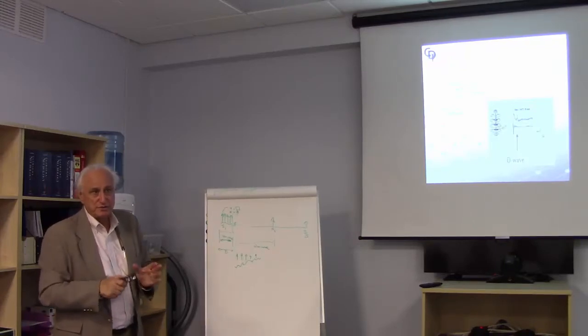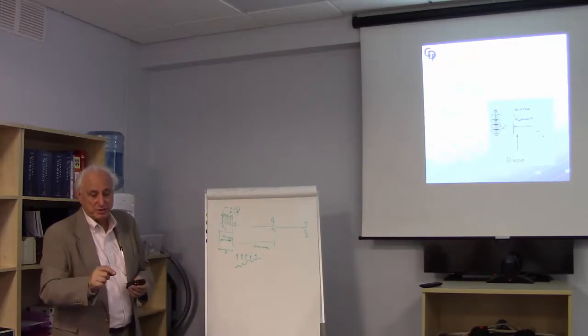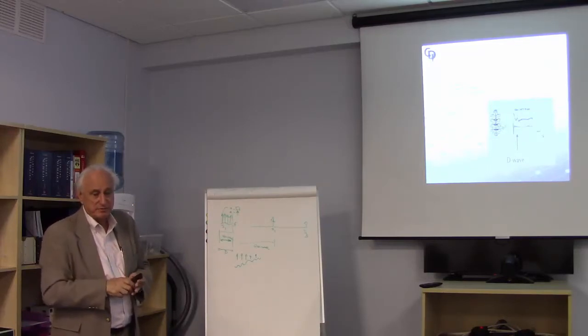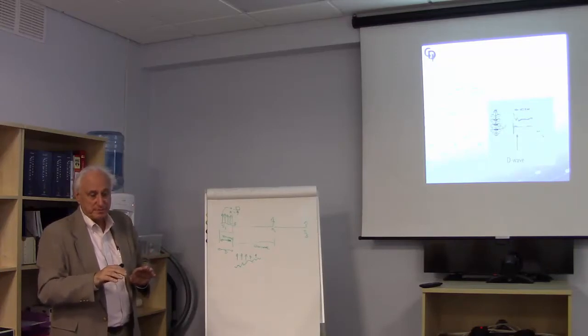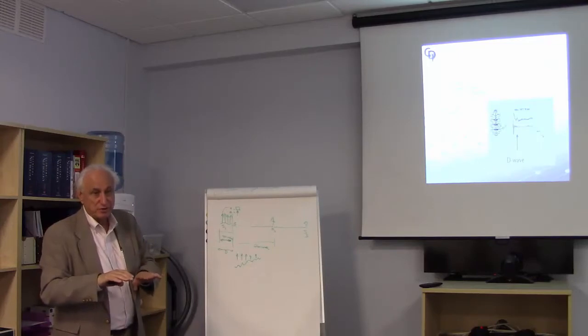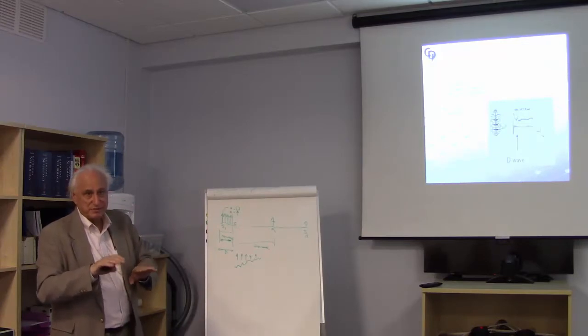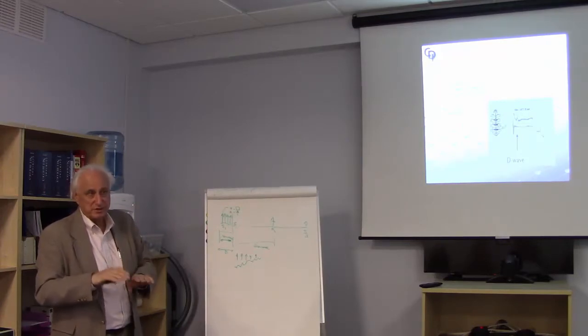Now there's another recording technique people use, which is a fine wire recording electrode, which is slid down. The problem with the fine wire is it doesn't cover the entire cord, but the grids will cover the entire cord. So you can see the activity from both sides of the cord, and you can actually tell which side of the cord is active and which side isn't.